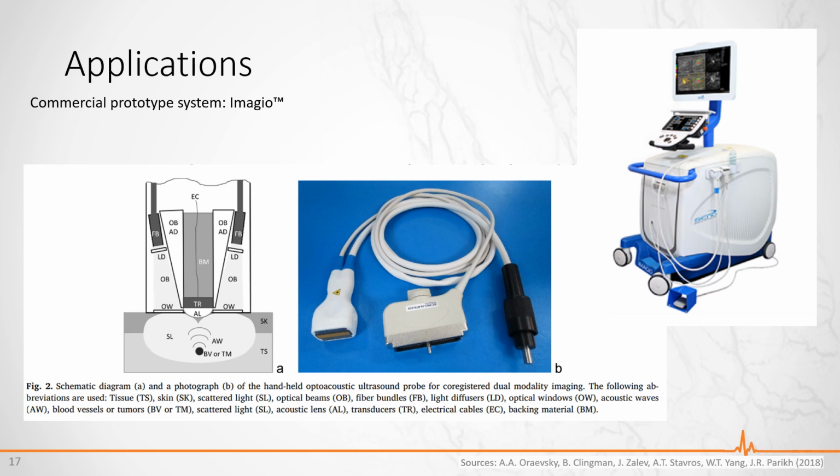The main focus of this device lies in detecting breast cancer. To understand its advantage, I give you a short reminder on oncology. When a tumor turns malignant and shows increased growth, it needs a lot of resources since it uses them much more inefficiently than healthy tissue.